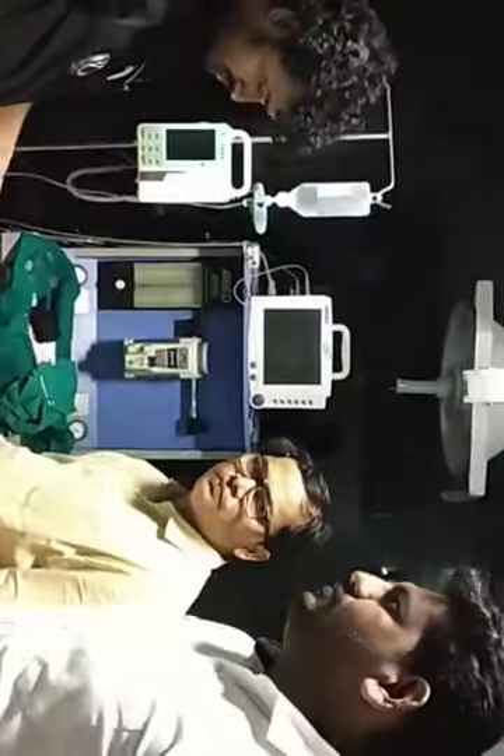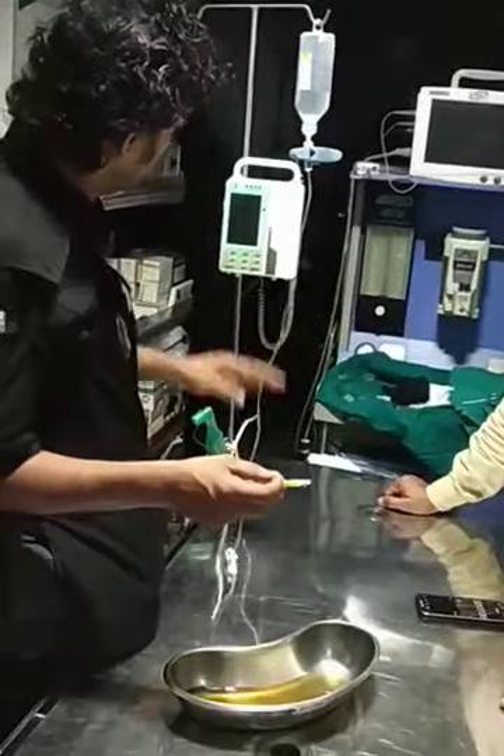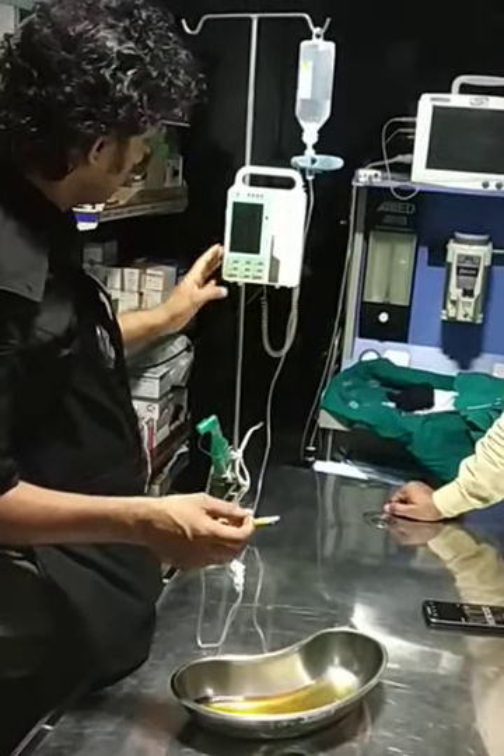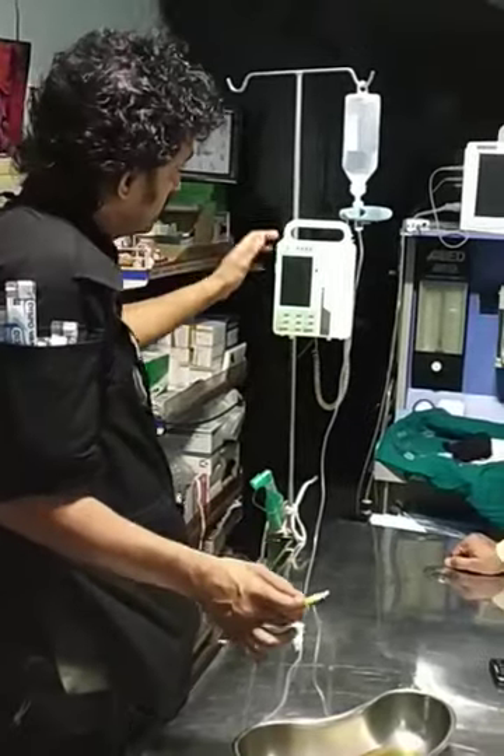Hi, I am Dr. Ashok over here and we are at CP West trying to see how the infusion set works. This infusion set is a really great piece of equipment because it is compatible with a 5 ampere plug and it works on a current.